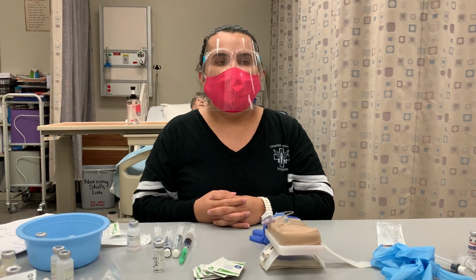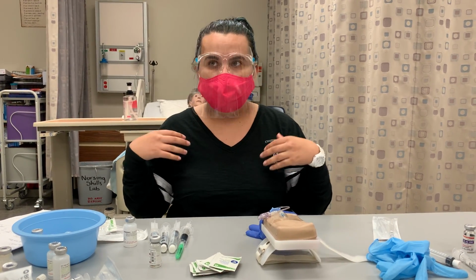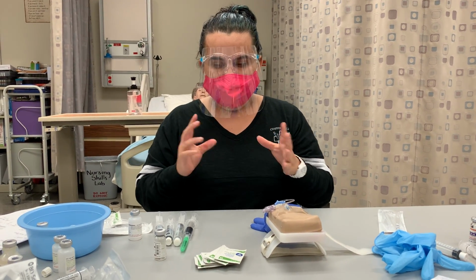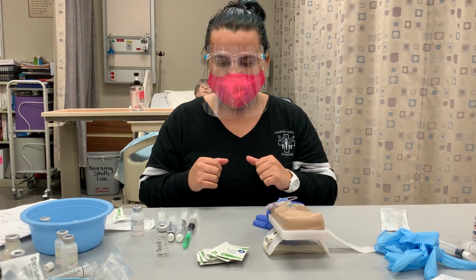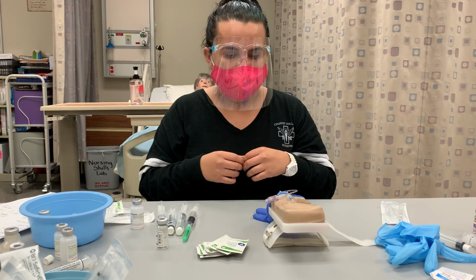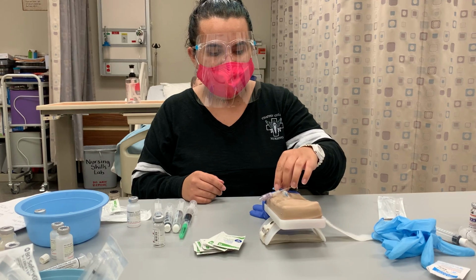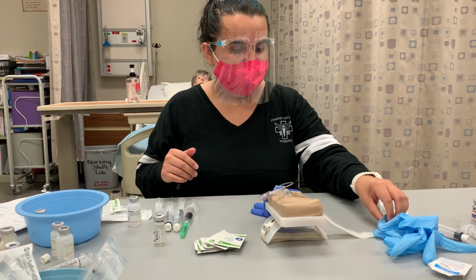I will identify my patient with 2 names, with 2 identifiers, and I will assess for allergies. I will assess for pain again, because I need to know that the appropriate medication is given for the proper pain scale. So from here, if I were to have a pump running, I would pause the pump, or if it's saline locked, then I'm okay, making sure that this is unlocked. So now I would apply my gloves.